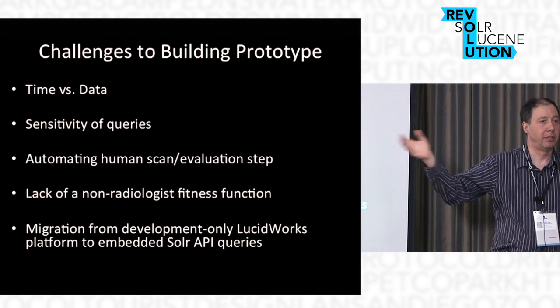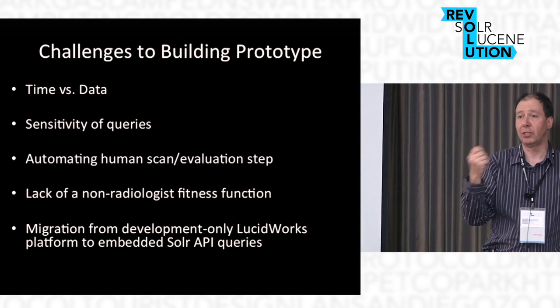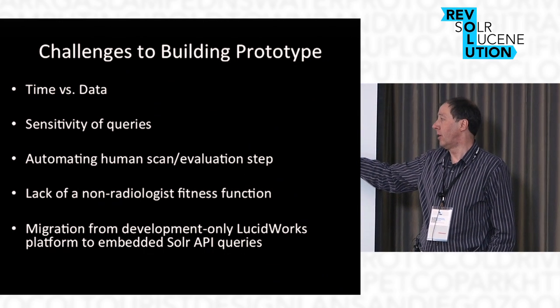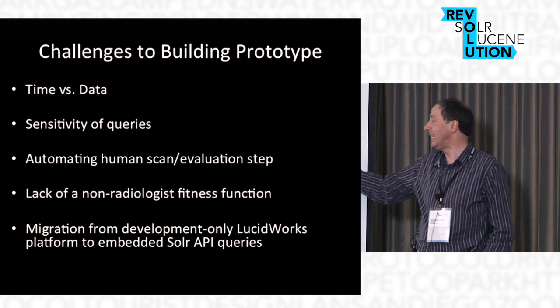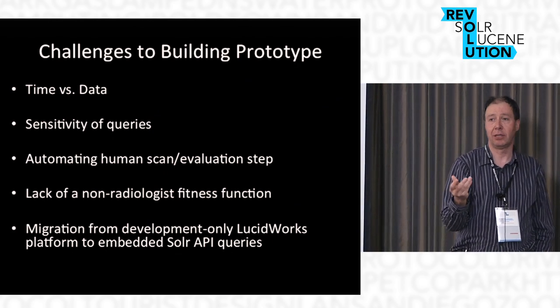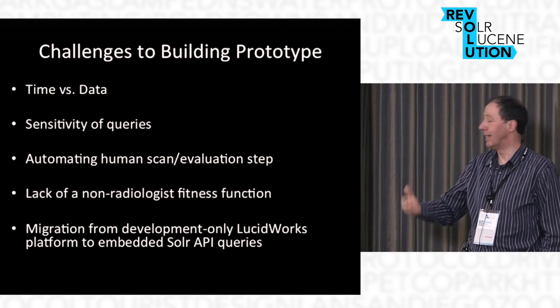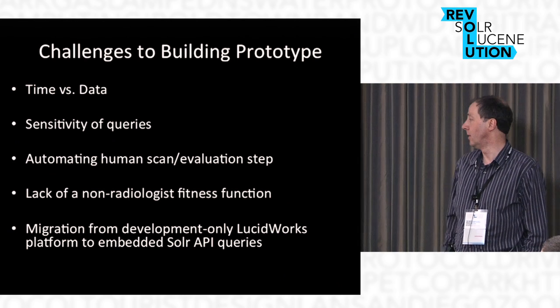The step where Dave looks at the images or the text and quickly decides which ones are valuable and which ones aren't valuable, we need to either find a way of automating or semi-automating that step, or at least incorporating it into the interface in such a way that it doesn't detract from what's going on, that it supports all the machine searching that's going on behind the scenes.